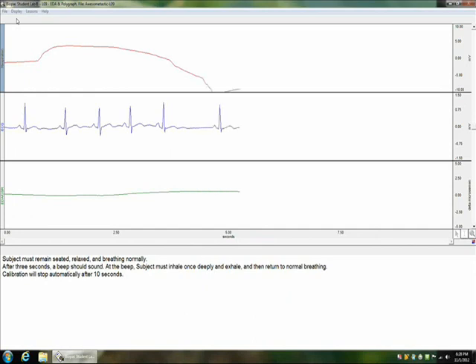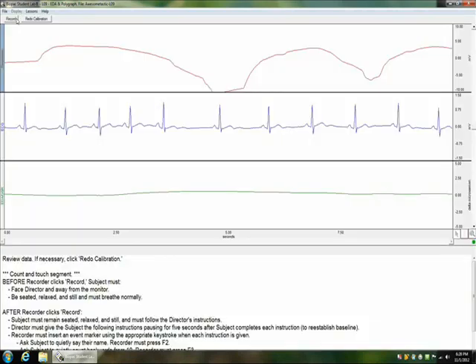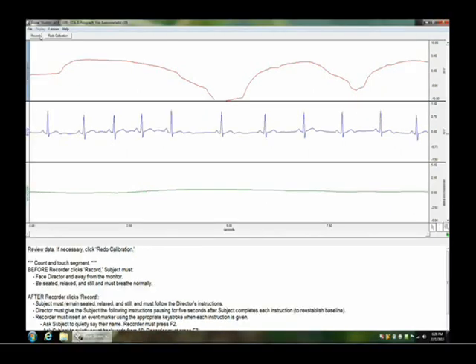Now, your results should look something similar to this. They don't have to look exactly like this, but if your respiratory peaks aren't as high or defined, or maybe you have no EDA graph, then you can go back, maybe adjust some of your equipment to get better results, and you can redo the calibration. If not though, and they look similar to this, you're ready to move on to running the experiment.